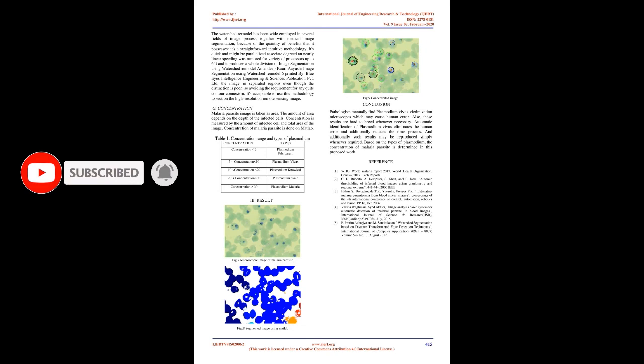division of the image into separated regions even though the contrast is poor, so avoiding the need for any kind of contour joining. It is suitable to use this method to segment high-resolution remote sensing images.